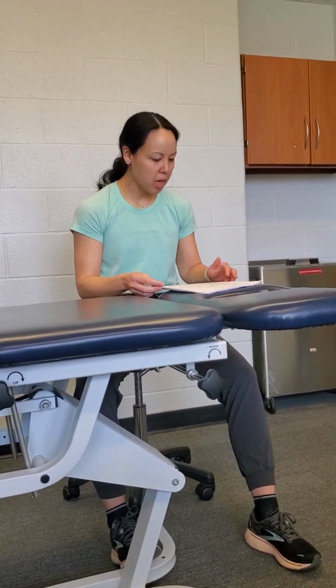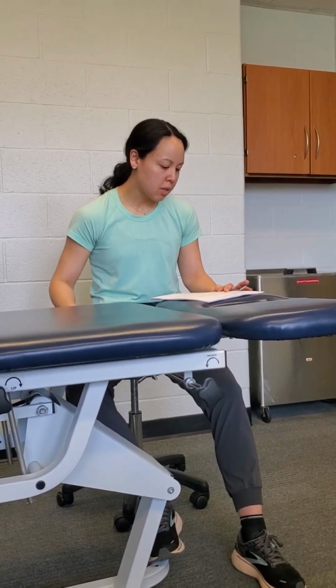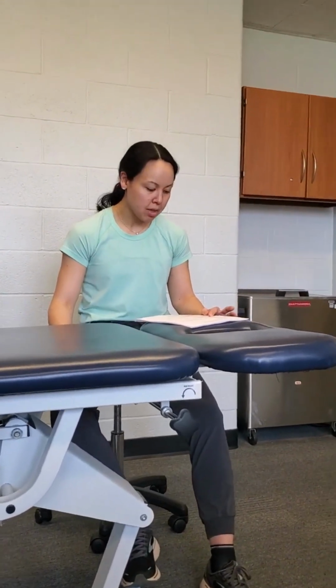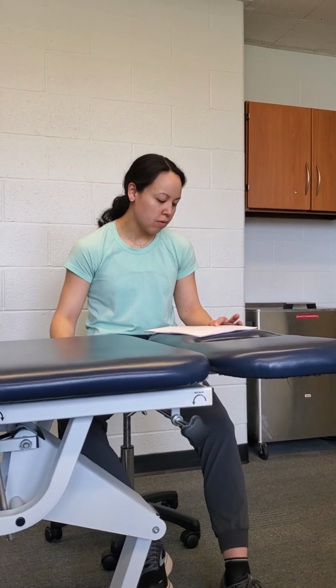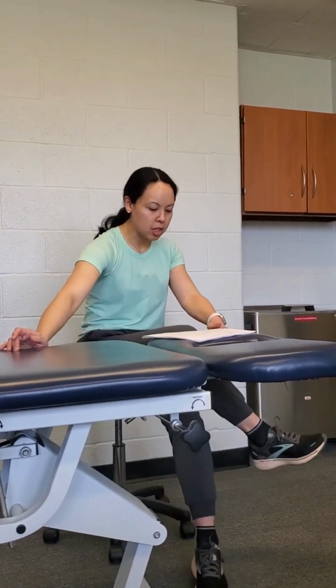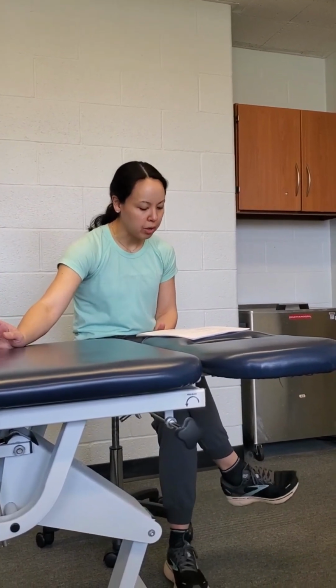Okay. And then it says when to use BFR. We can use it very early in the rehab to limit atrophy and restore and maintain muscle quality, to hit multiple targets in older clients, on days where pain might limit exercise, to reduce pain prior to loading heavy, as a light day in a rehab block, as a finisher to ensure sufficient volume, or as a means of maintaining general fitness. The principle is basically that you're blocking the venous return but allowing partial arterial flow.